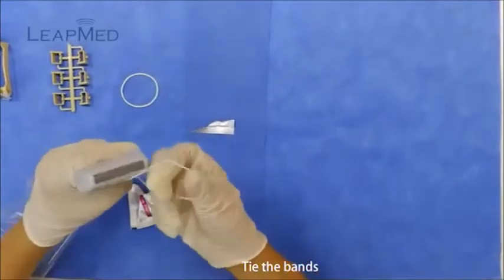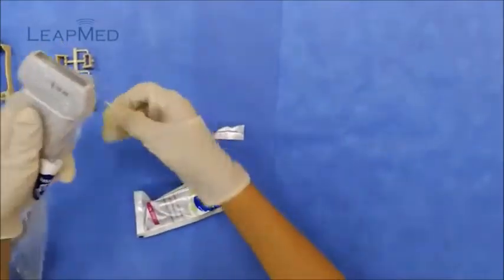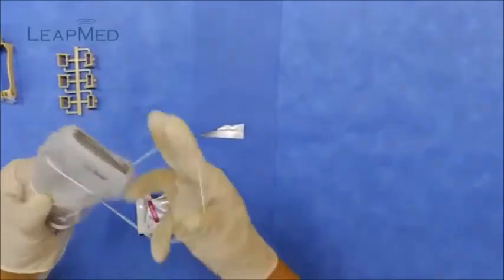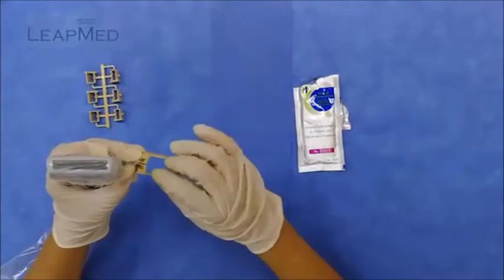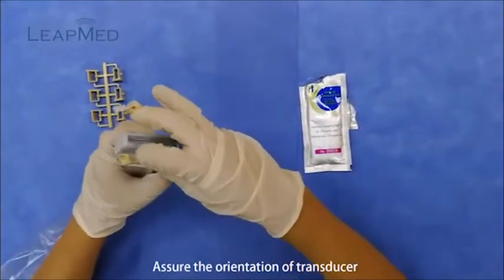Tie the two bands. Assure the orientation of the transducer. Fasten the guide.